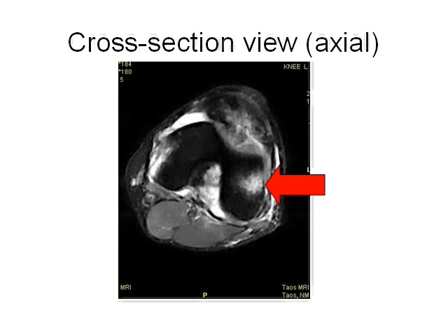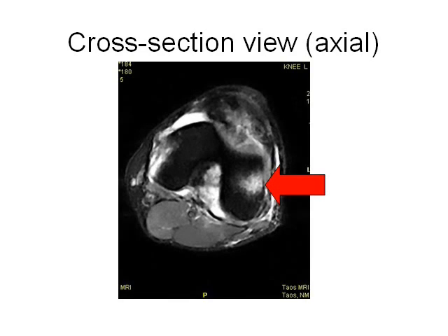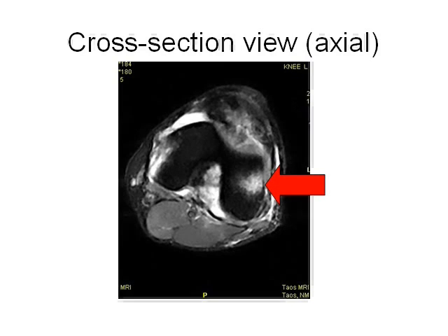The cross-section or axial view shows other clues to a torn ACL. The red arrow shows a white bone bruise in the dark femur or thigh bone. The bruise occurs when the ACL is torn. White fluid around the black femur shows the knee is swollen, which also occurs when the ACL is torn.